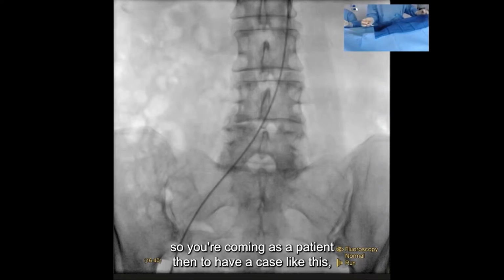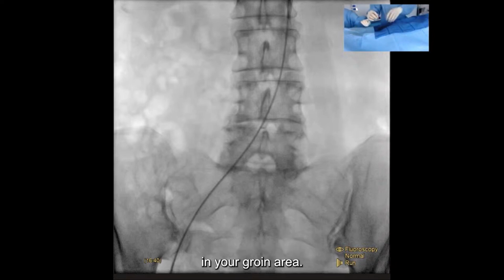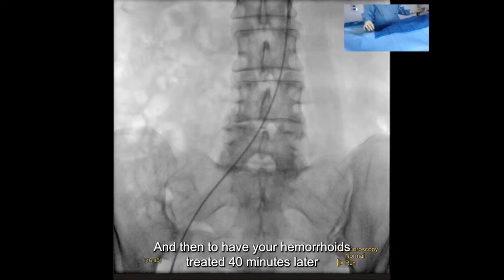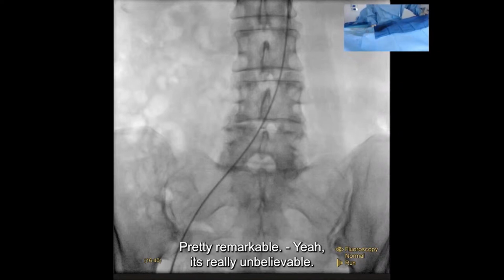To come in as a patient and have a case like this, where all you're doing is getting a single puncture in your groin area, and all you're feeling really is the lidocaine shot. And then to have your hemorrhoids treated 40 minutes later without feeling pain during the procedure. Really remarkable. Yeah, it's really unbelievable.